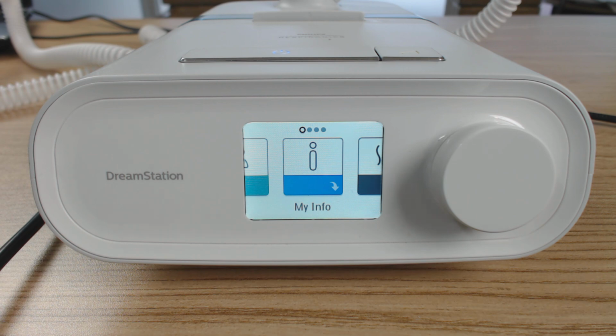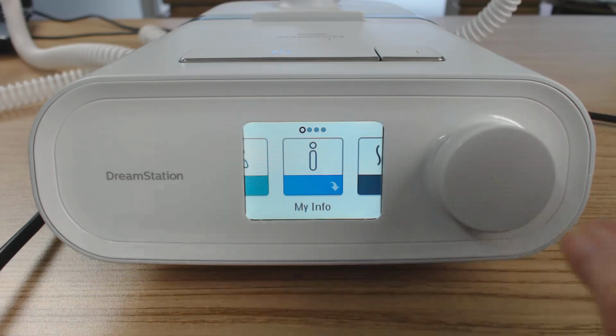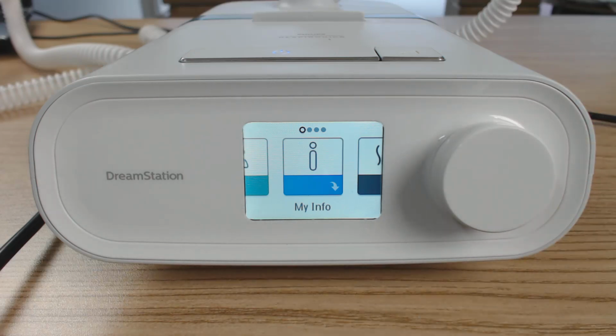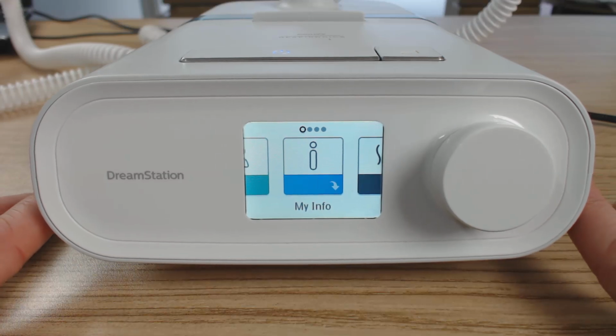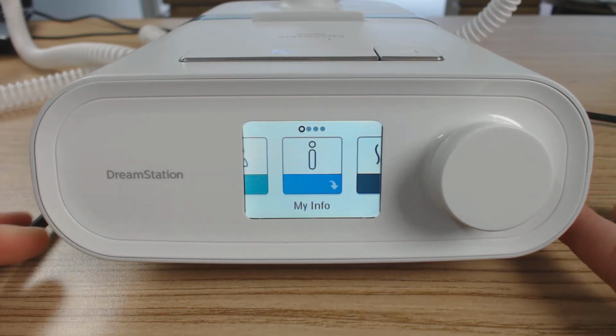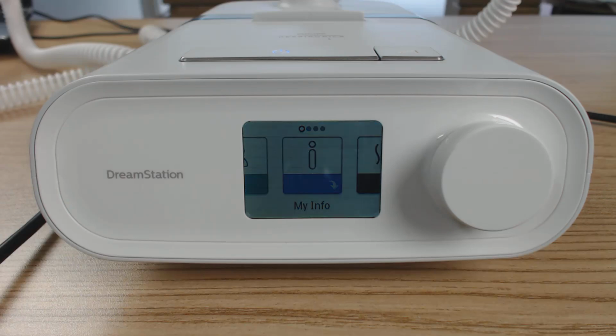So this machine has a very user-friendly menu system. It uses icons. It has a lovely dial here that you can rotate and click in. So we're going to go through and just talk about it. This is the actual Pro, so this is the fixed pressure one. You might have an automatic one, which might be a little bit different, but the usability of them is very similar, and the interface is very similar. So without further ado, let's have a look.